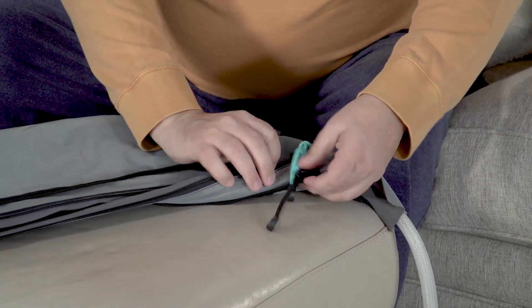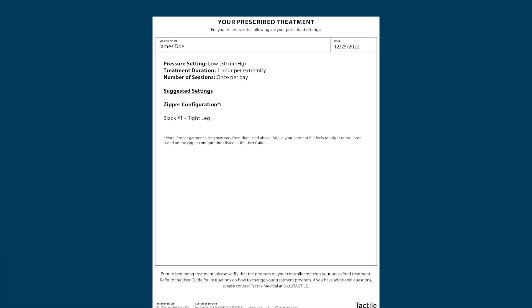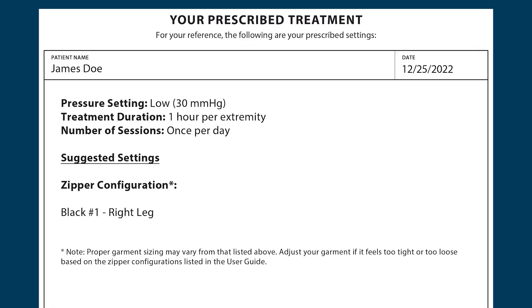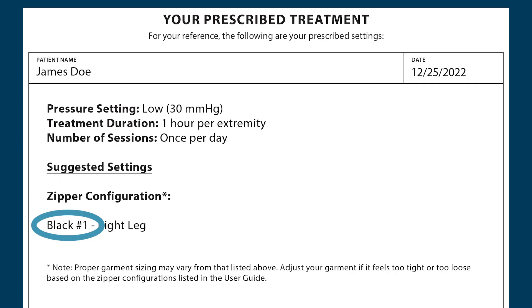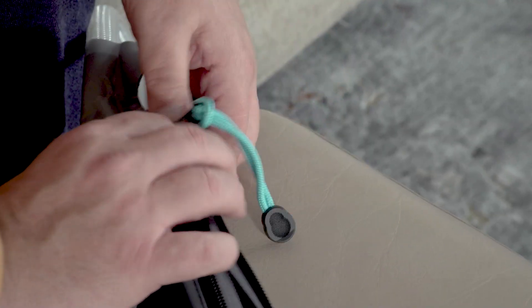To do this, connect the colored pole string detailed on your prescribed treatment card to the appropriate numbered zipper. For example, if your prescribed treatment card indicates black 1, you will need to connect the black pole string to the zipper labeled number 1.